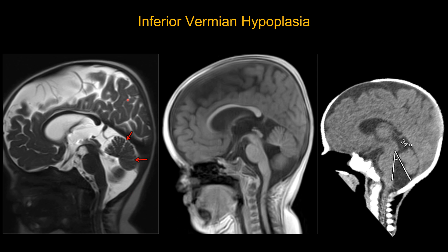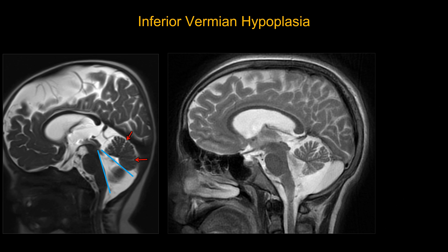Here's another example of inferior vermian hypoplasia with T2-weighted, T1-weighted, and corresponding CT images showing a measurement of 34 degrees TV angle. Compare that to this entity where the TV angle is not abnormally widened. There is enlargement of the cystic space inferior to the vermis, but the inferior vermis does not appear significantly smaller than the other two sections. There is mild mass effect on the inferior vermis and mild hydrocephalus, making this one Blake's pouch cyst.